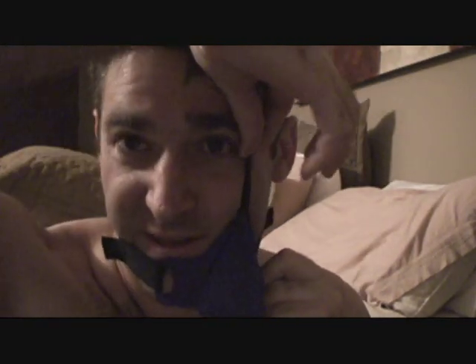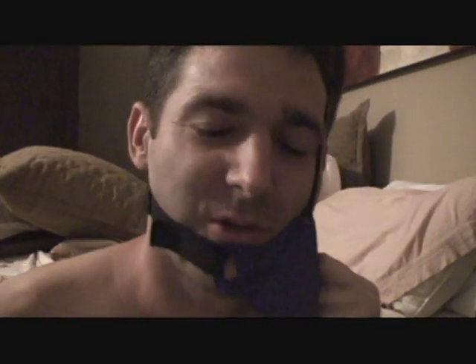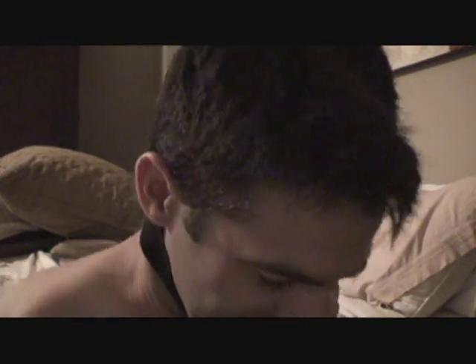Just a little trick I learned. Oddly, I find that if I have leaks down here at the bottom, look at my nose. That's not an easy nose to fit. I find that if I have leaking at the bottom, if I tighten this strap here up, it seems to get rid of that. I read their tips on how to fit this and get rid of leaks, and some of them seem to work and some don't. Then I saw tips by other users, and it seems like some of them work and some don't. I say try all kinds of stuff.